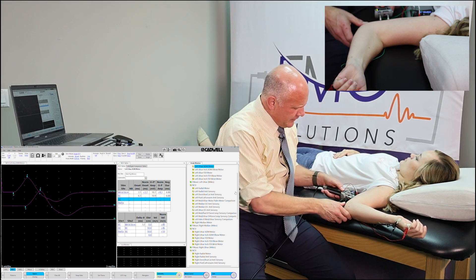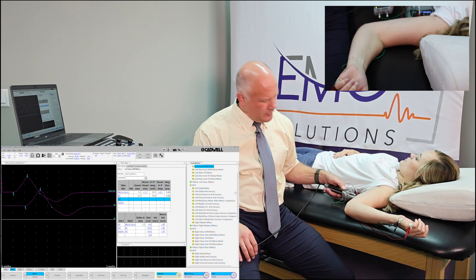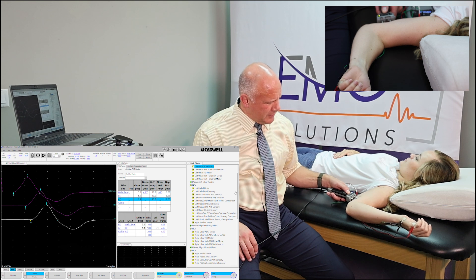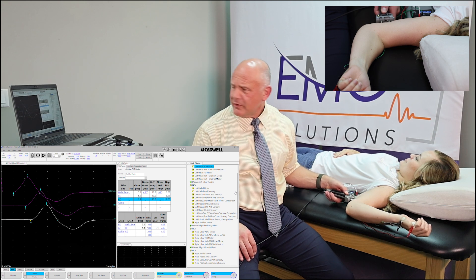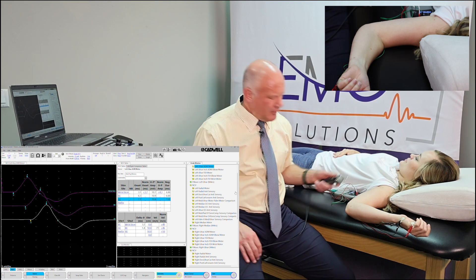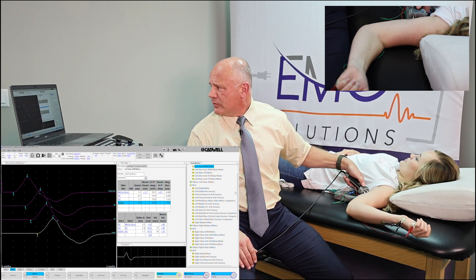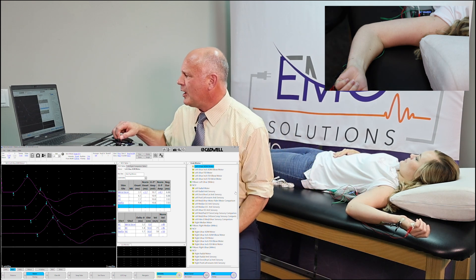Now we're going above the elbow. You'll notice I've still got that cathode distal and closest to our active electrode. We stimulate right there — got just a little bit of motion from this patient. I'm going to take the stimulus intensity down just a little bit because she's a little uncomfortable. We'll stimulate one more time — good solid baseline. Then we'll stimulate once more a little higher on the arm for this last segment. Nice response right there.